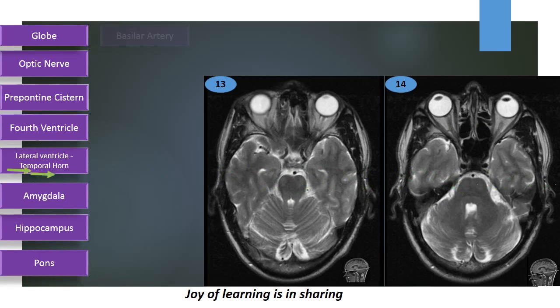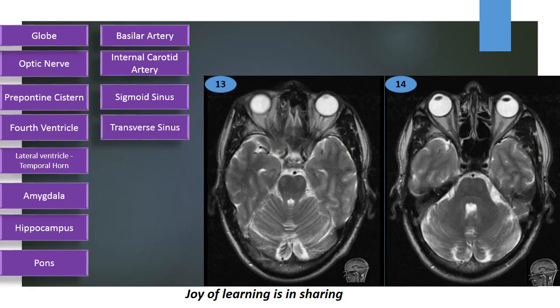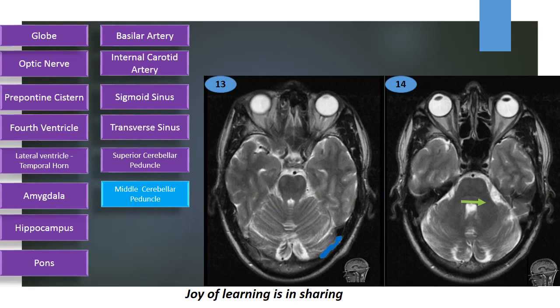Pons, basilar artery in the prepontine cistern, internal carotid artery in the cavernous sinus, sigmoid sinus, transverse sinus, superior cerebellar peduncle, middle cerebellar peduncle.